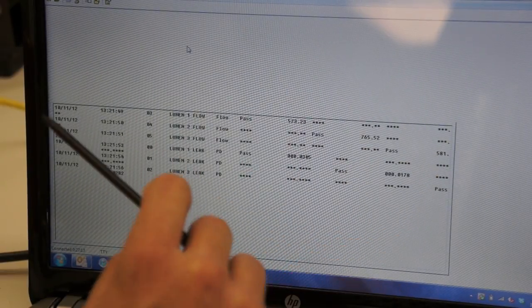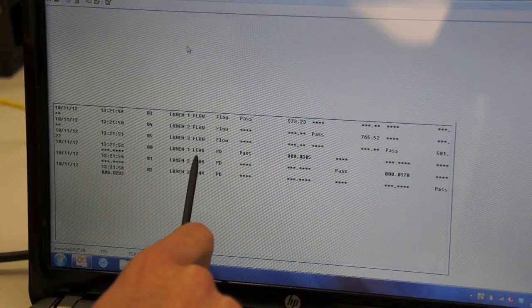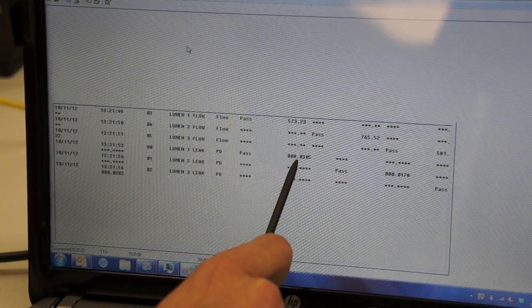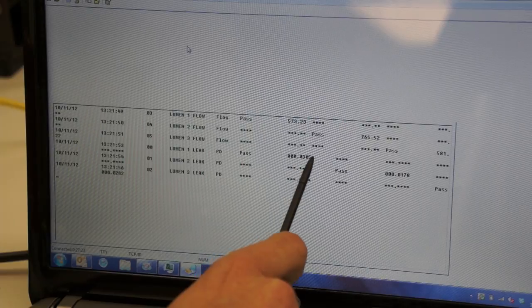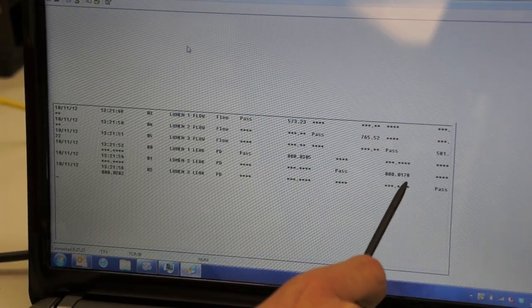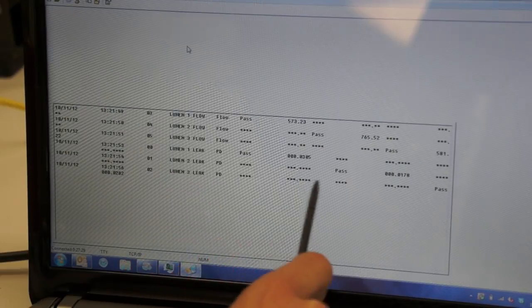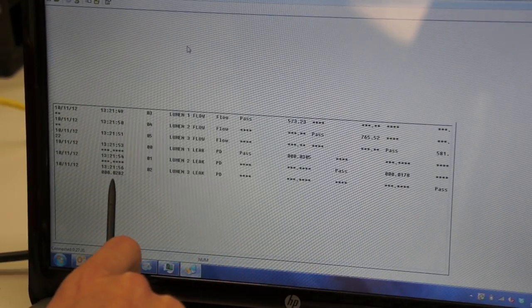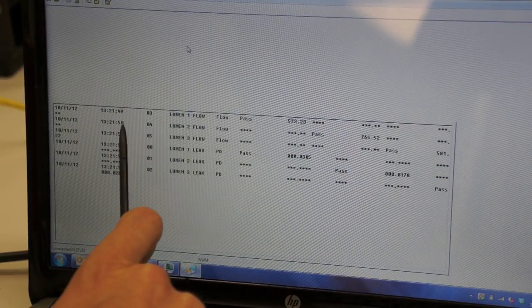Then we moved to the leak tests. Lumen 1 leak was a pass with a decay of 0.0305. Lumen 2 leak passed with 0.0178. And lumen 3 passed with 0.0282.